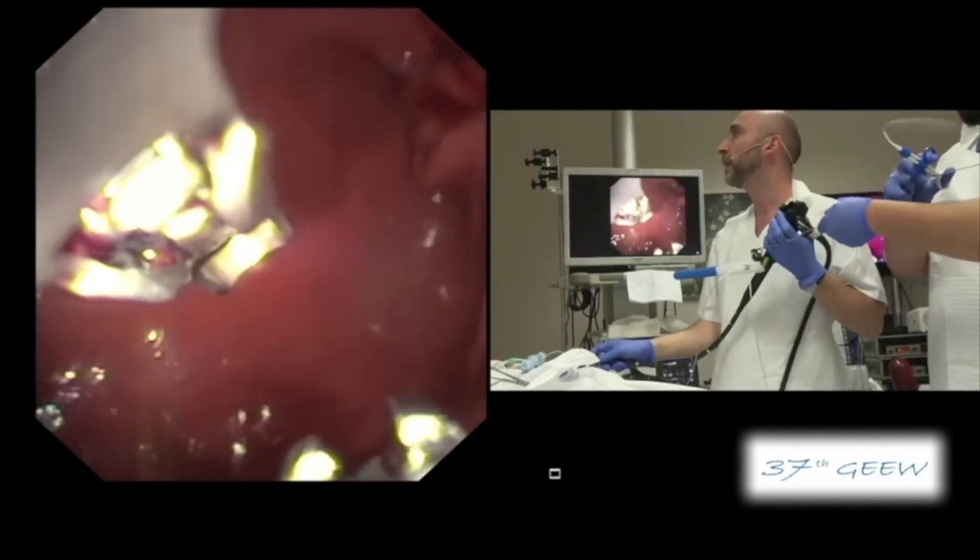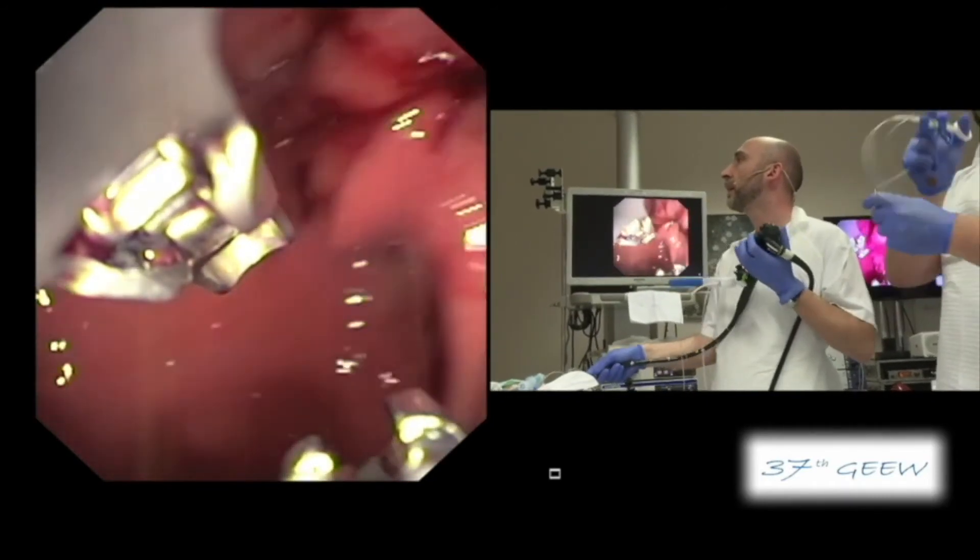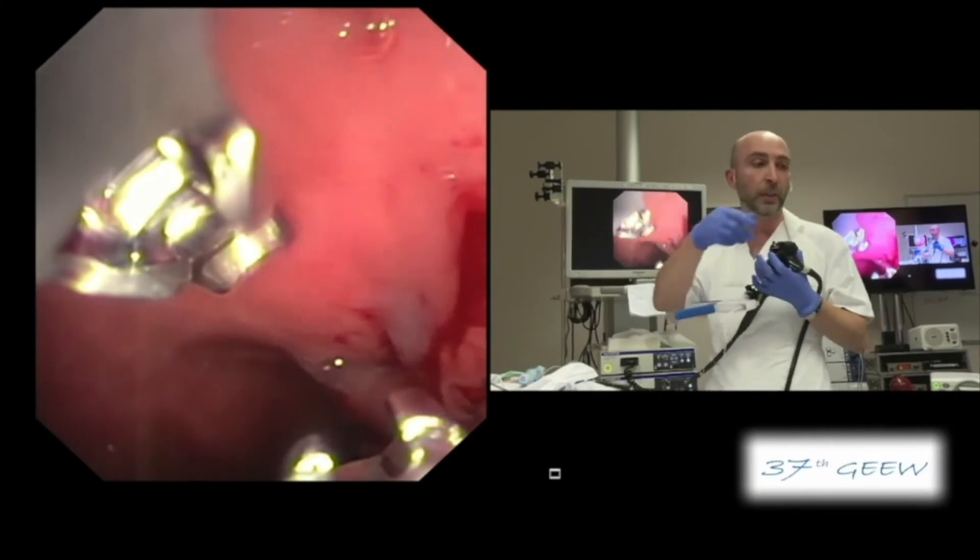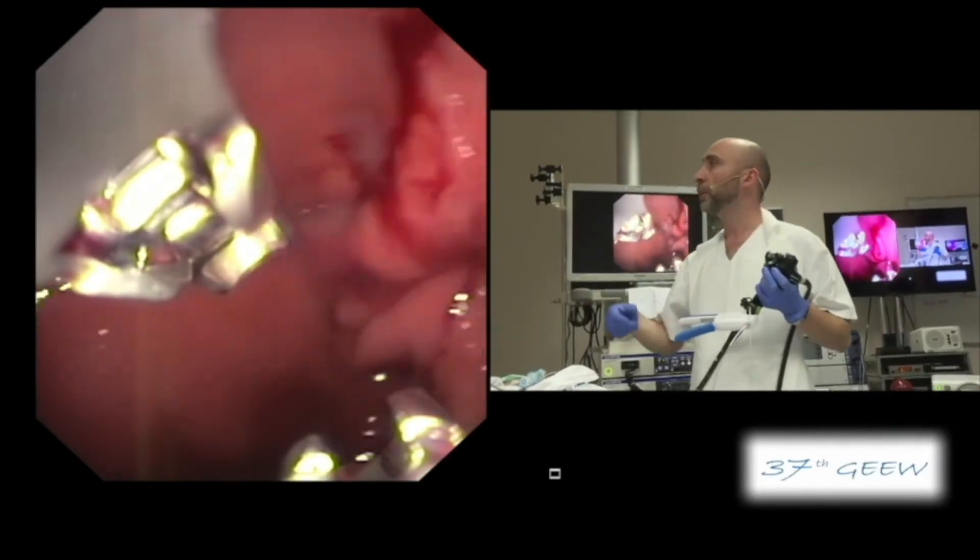So the first row has been placed. You can see here and here is the tunnel. So we are proceeding with the second row.